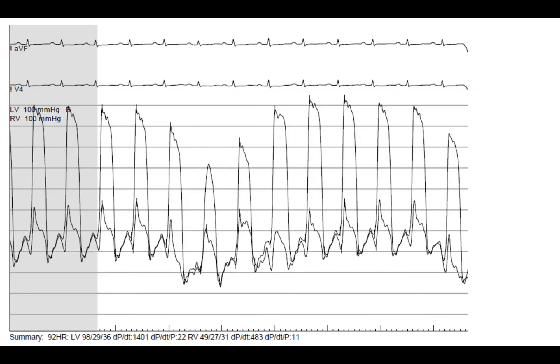This is a simultaneous recording in this patient of left ventricle and right ventricle. This is the single most important recording when you're considering that differential diagnosis. I want you to look at this pressure tracing and tell me what you think of it — what's the single most important measurement to look at on this recording?